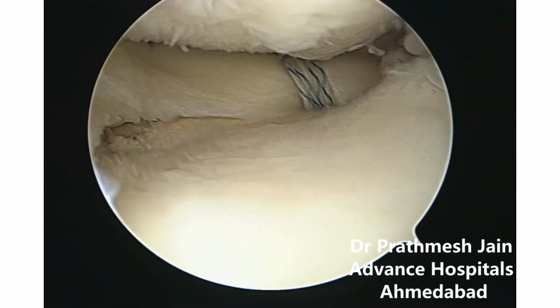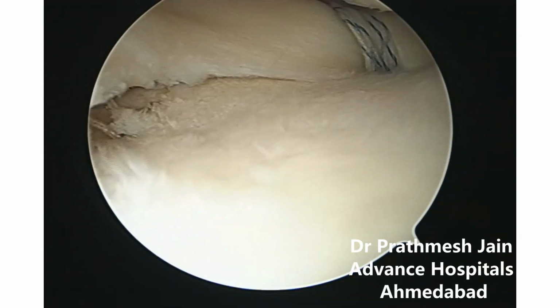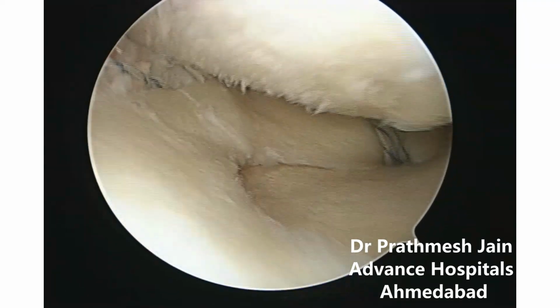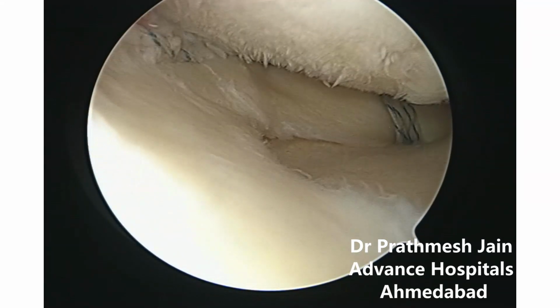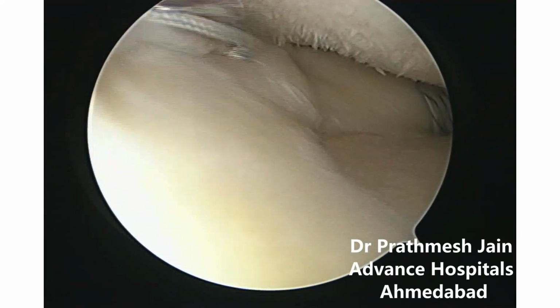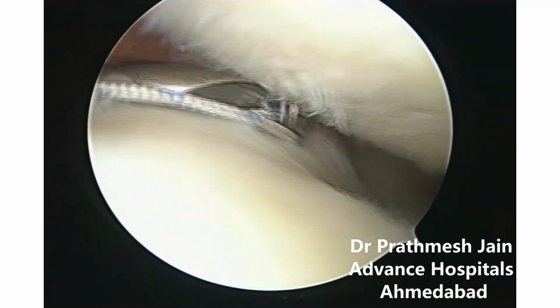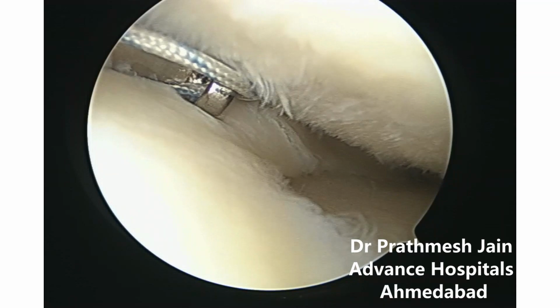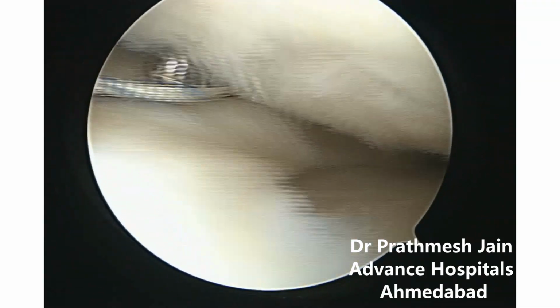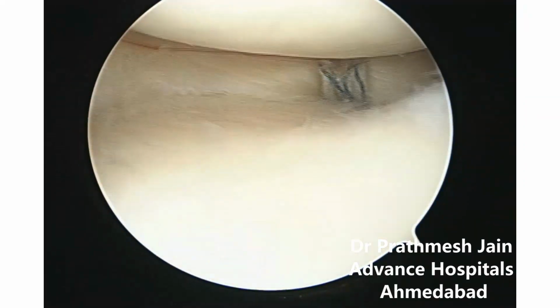Once the root is repaired, we will focus our attention on the anterior part. You can see that there is still some bone exposed on the anterior part of the footprint, the chondral area which is exposed, and we need to reduce the extrusion and cover that area of the footprint as well. So we use a knot pusher to tie this knot on the anterior aspect of the reduction. The tibial chondral area which is exposed will now be covered with the meniscus extrusion suture repair.